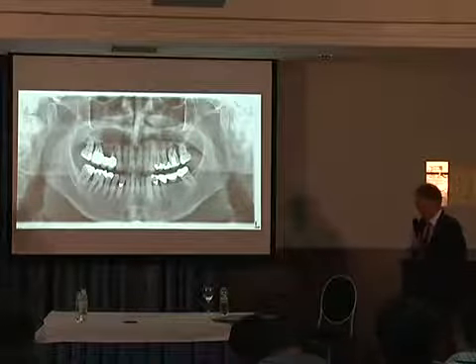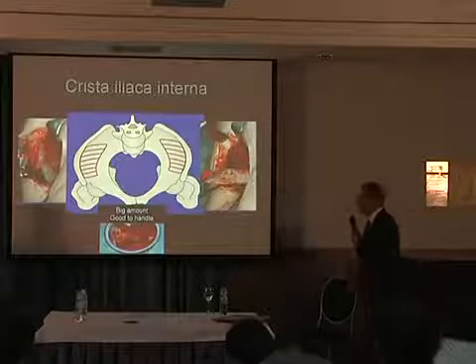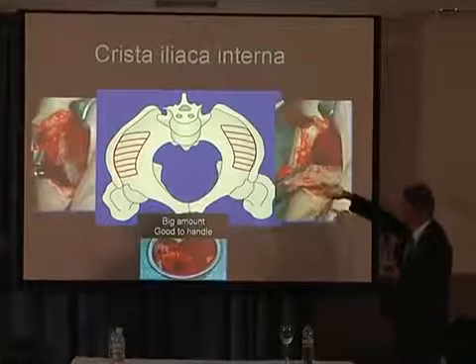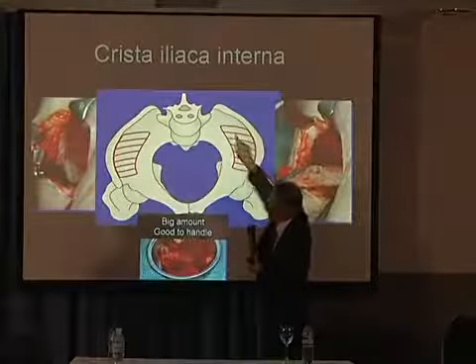На верхней челюсти он сейчас очень быстро нам покажет это все. Bone harvesting with piezoelectric surgery from crista iliaca interna. From the middle part, or the front, on anterior part. Here, in the middle and anterior. All right. Okay, here.